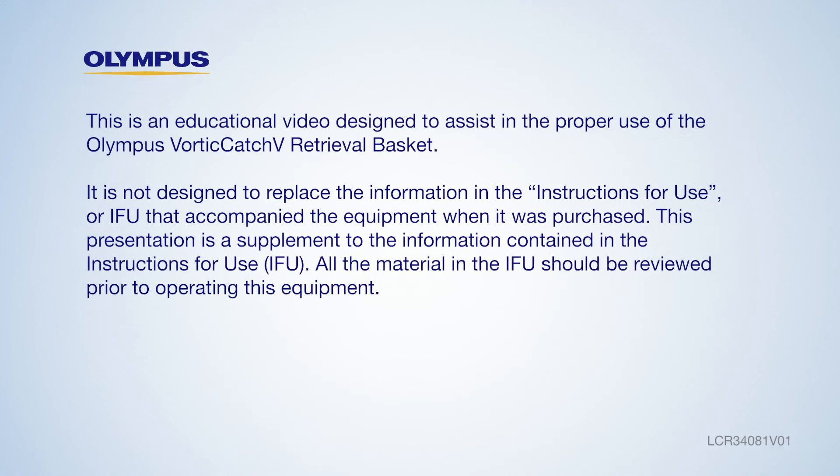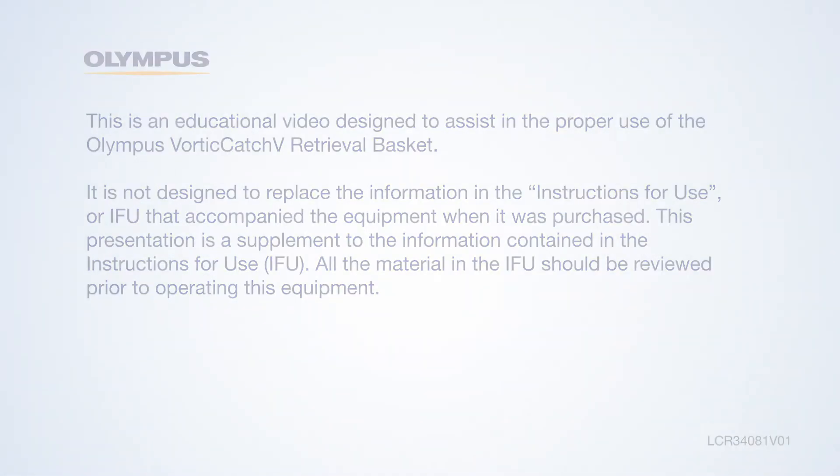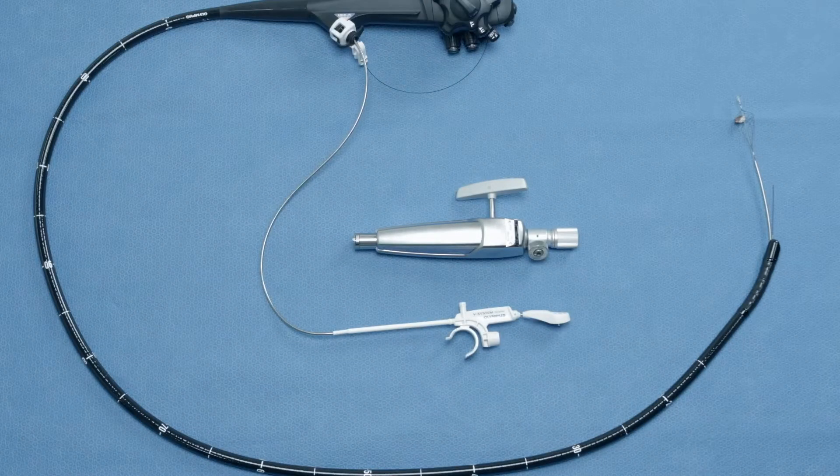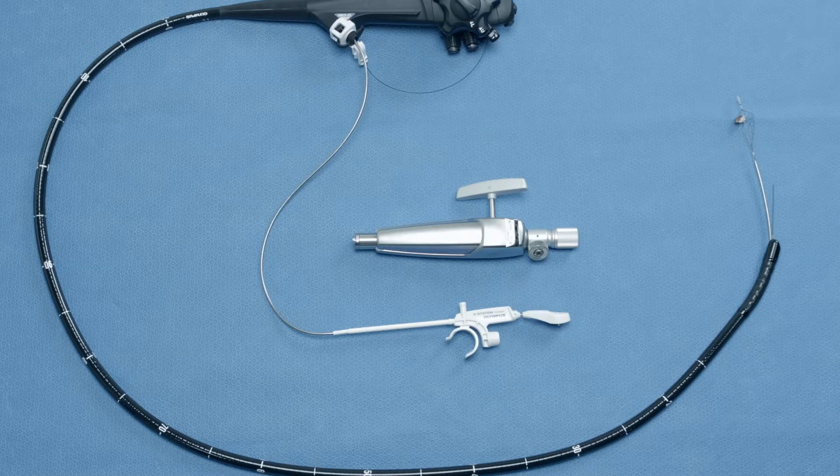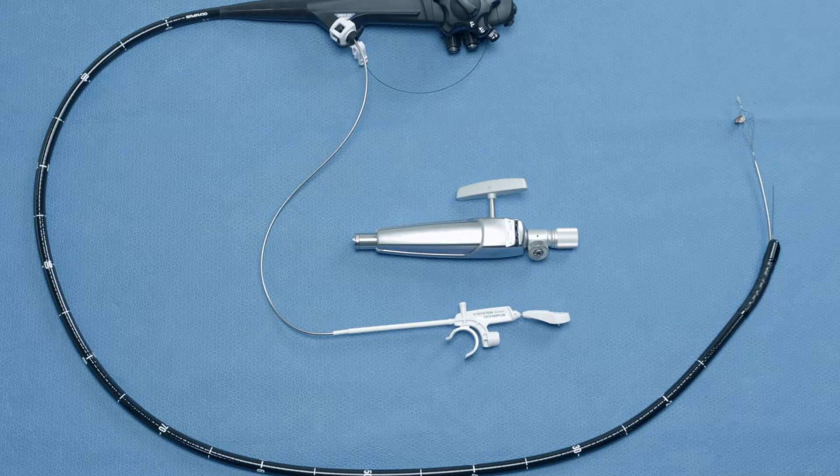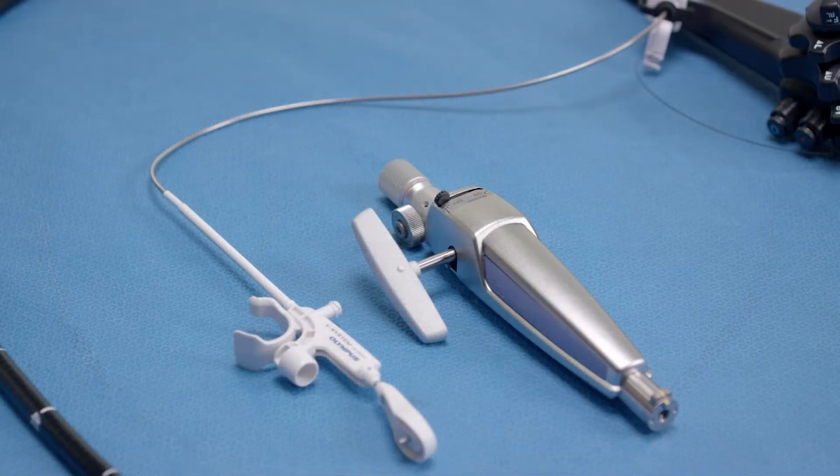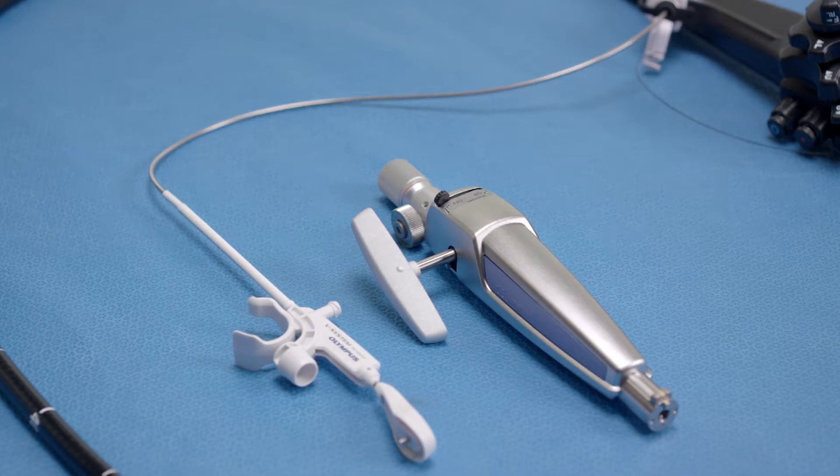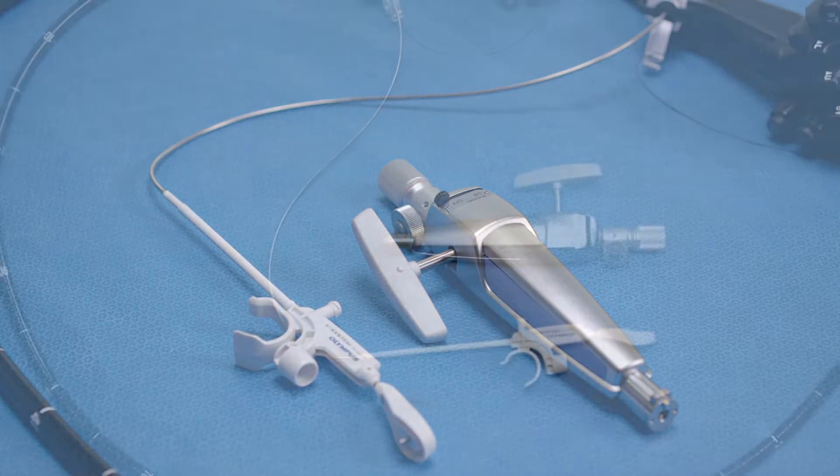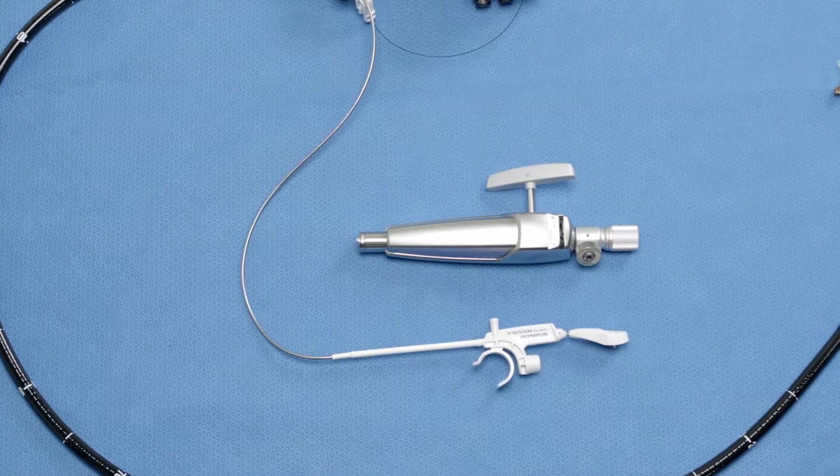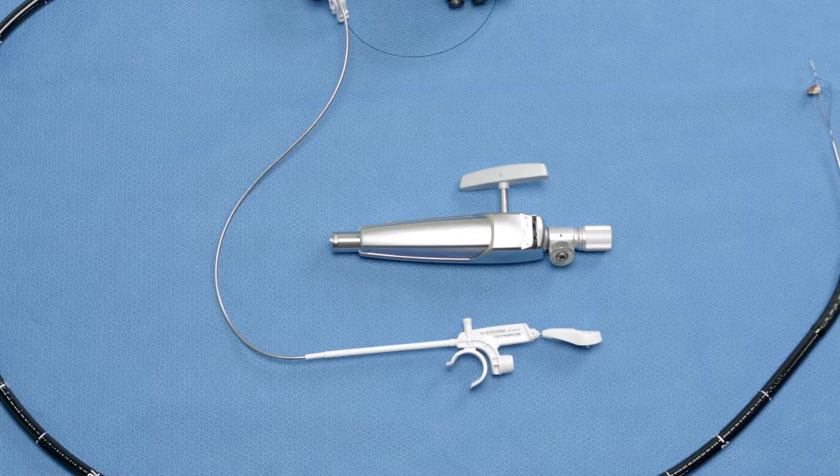Welcome to the VortiCatch V Retrieval Basket Emergency Lithotripsy In-Service. Let's review how to assemble the VortiCatch V Retrieval Basket to the Lithocrush V Mechanical Lithotriptor Handle. In the event of basket impaction, the VortiCatch V Retrieval Basket may be assembled to the Lithocrush V Handle for Emergency Lithotripsy.